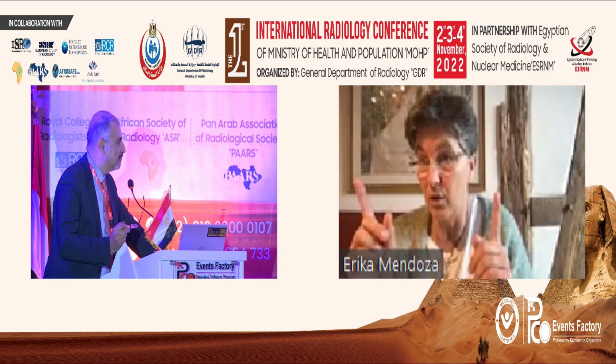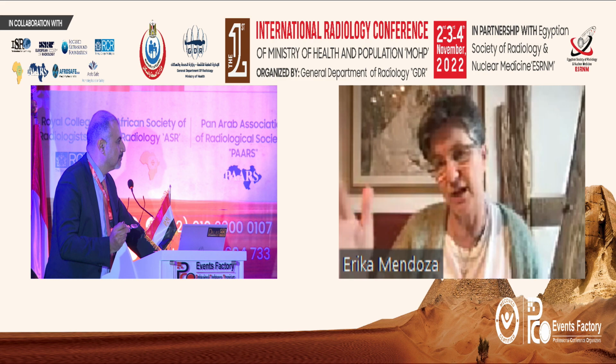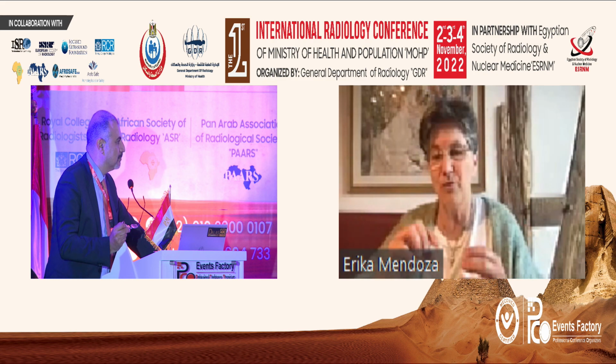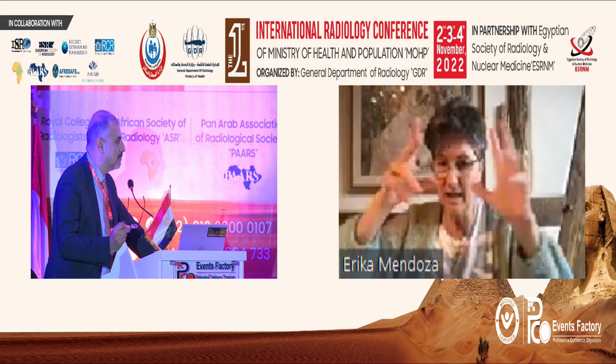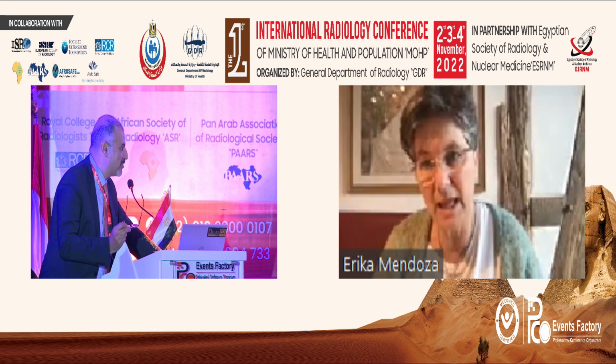If the stump is very long, nobody was even near to the place. But if the stump is short, you can do it with foam. Then you have the question: are there lots of little tiny vessels? Yeah, in the lymph nodes and everywhere you have new vasculature.